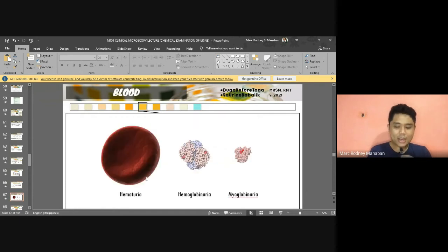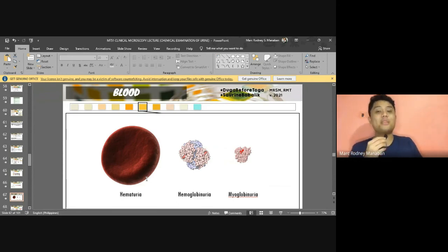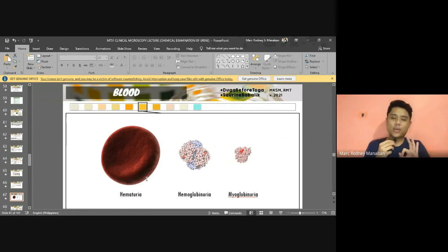Alright. Now, the last parameter for this lecture, or for this video, we have blood. Very important, because we are actually detecting three disease states in one: hematuria, hemoglobinuria, and of course, myoglobinuria. When you say hematuria, it's in the name: the presence of RBCs, red blood cells. Hemoglobinuria is the presence of hemoglobin in your urine, and myoglobinuria, the presence of myoglobin. These three can be detected by the blood reagent pad in your reagent strip. That's why we have to discuss them.